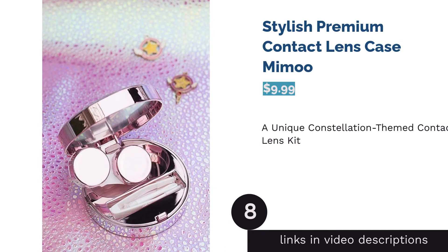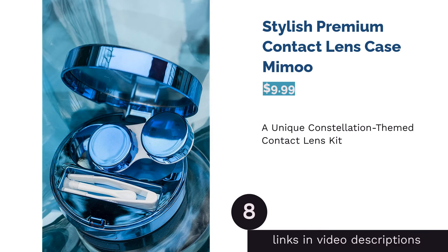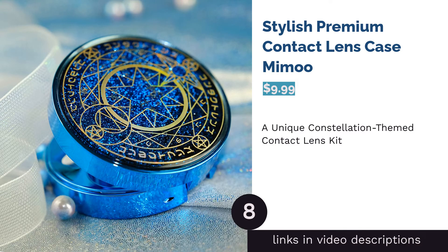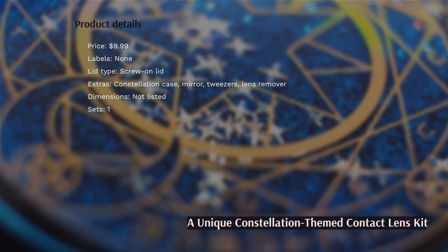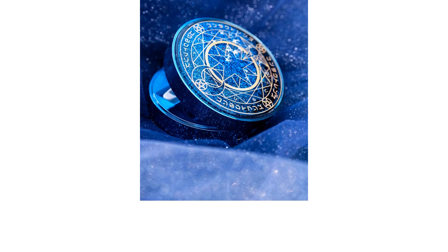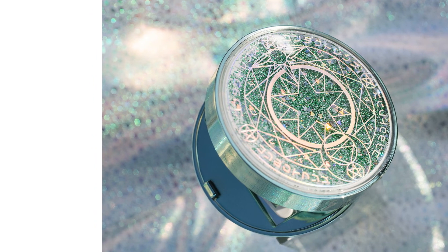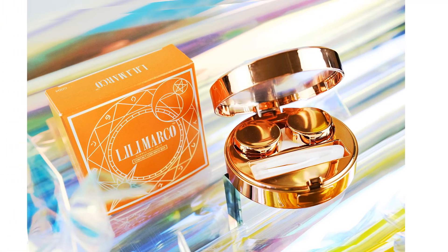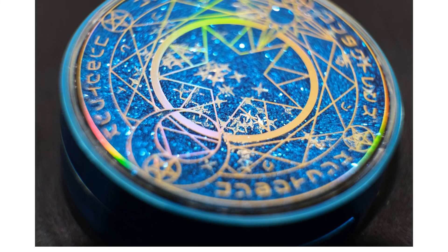The next product in our list is the Stylish Premium Contact Lens Case by Memu. This magical and shimmery contact lens case comes with a unique constellation design, and its aesthetic is matched with practicality thanks to the useful tools included. Besides a contact lens case, this kit also gives you a mirror, a pair of tweezers, and a lens remover tool. Since the actual lens compartments aren't color-coded and don't have labels, you may want to consider this case only if both your lenses have the same prescription.